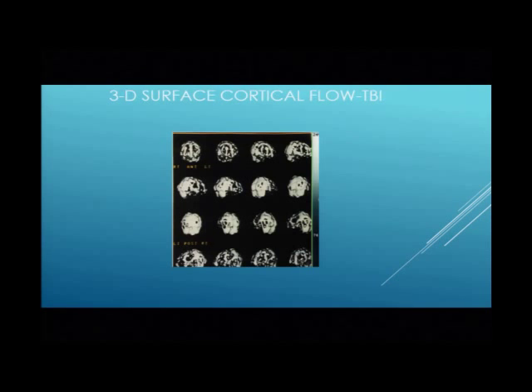Here's the 3D. Does everybody kind of remember what the other one looked like? It was all white. I'm going to give you another comparative slide on the next slide. But just to show you this, here's the view from the front. Sort of looks like a monkey. But when you look at this carefully and critically, what you see is that all these black areas are decreased blood flow in the frontal lobe. As the brain rotates to the right, you see it's all over the right side of the brain, but here's the back, and that's a lot better.